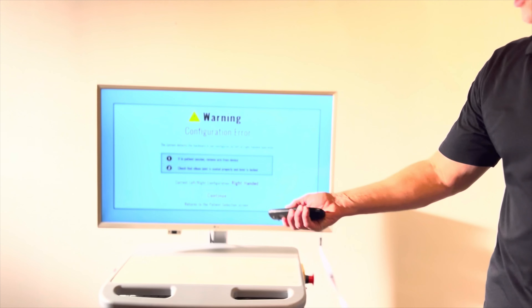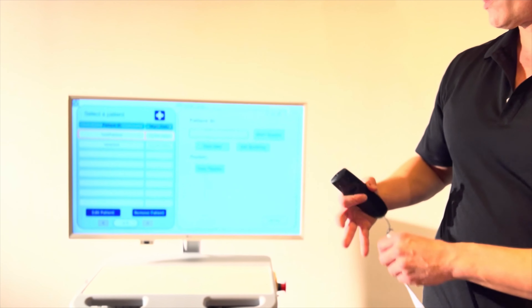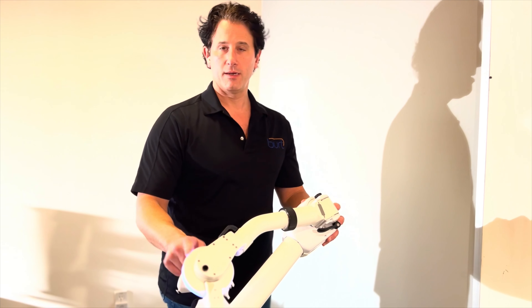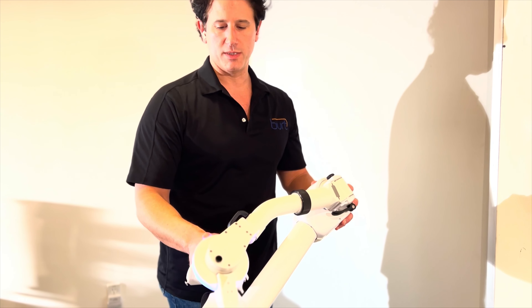You can get rid of the error message by using the mouse, or just the enter button on the remote. Now that I've done that, this is loosened up again, and this piece is now white again.